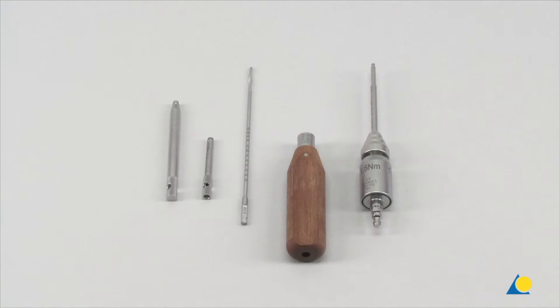The instruments required for the locking screw insertion procedure include the bending pin for LCP plates 3.5 with thread, the LCP drill sleeve 3.5 for drill bits 2.8 mm diameter, the LCP drill bit 2.8 mm diameter, the handle for torque limiter, screwdriver shaft hexagonal, and the torque limiter 1.5 Nm.